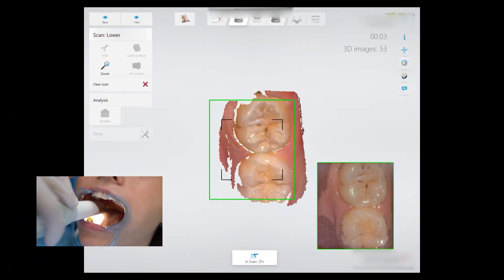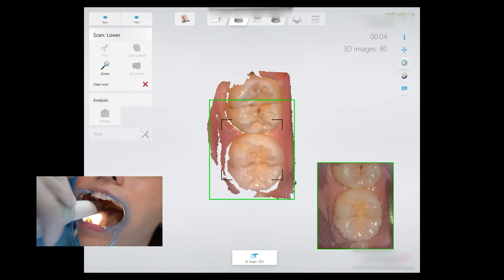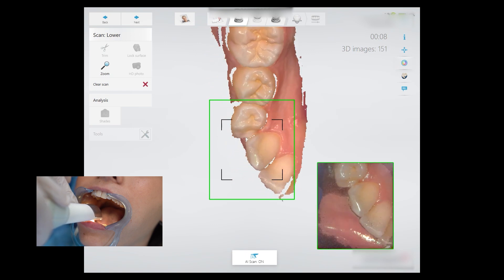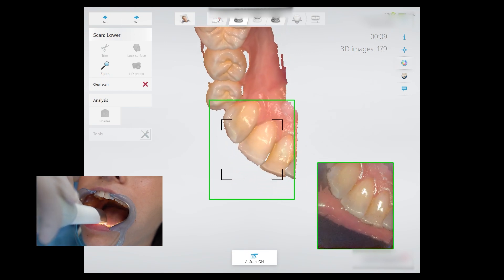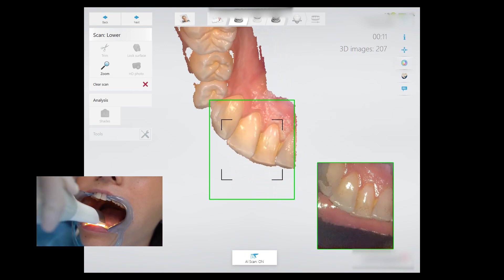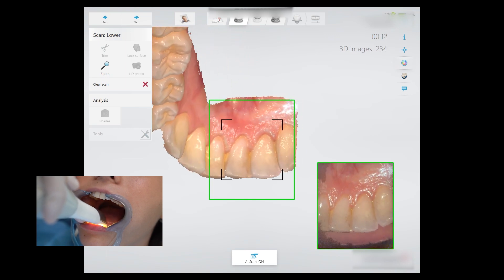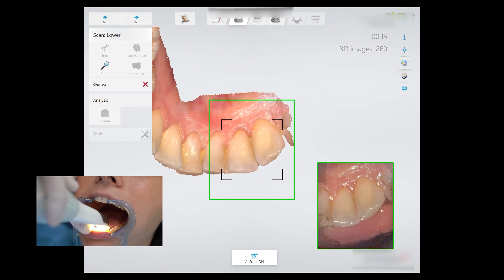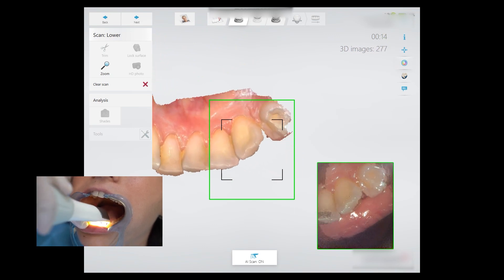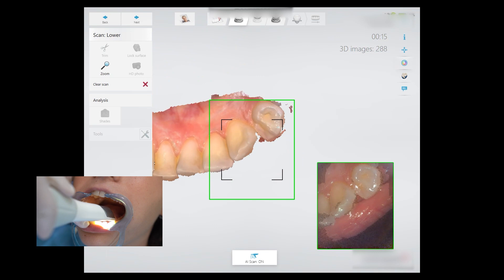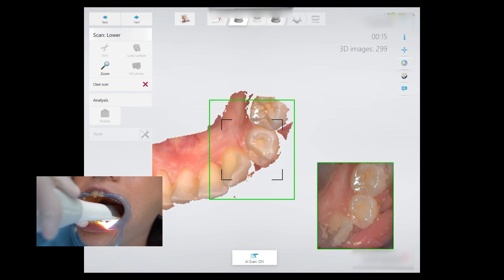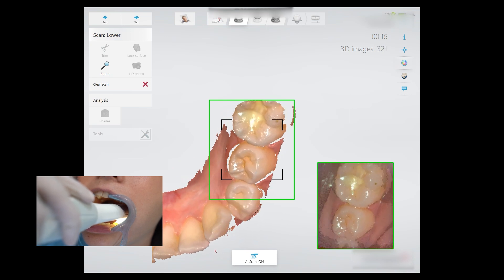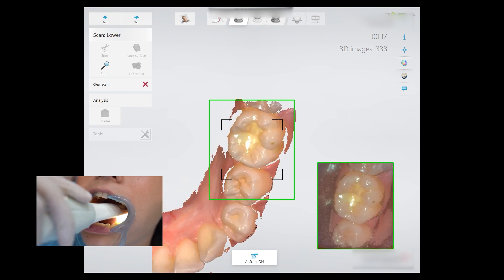When you capture the occlusal surface of the terminal molar, move toward the bicuspid on the same side while scanning the occlusal surfaces of molars and premolars. When you reach the bicuspid, tilt the scanner slightly lingual and scan the lingual surfaces of anterior teeth until you reach the contralateral bicuspid, then move the tip back to the occlusal surface and scan steadily toward the terminal molar, covering the occlusal surfaces of premolars and molars.